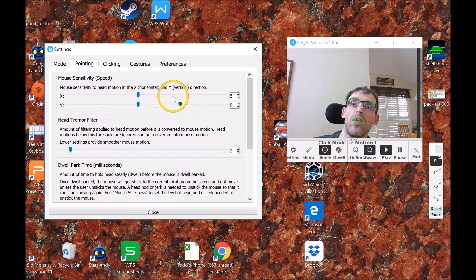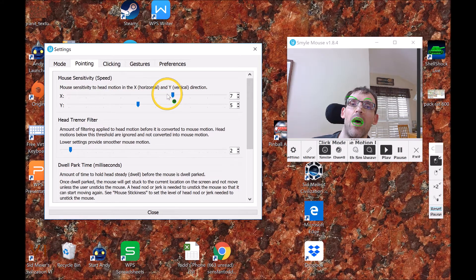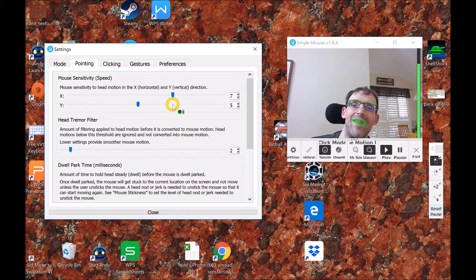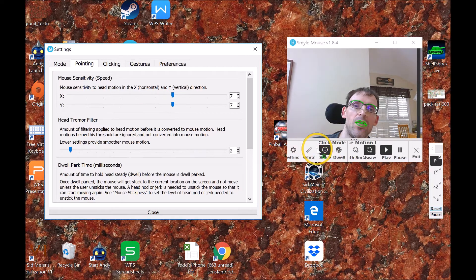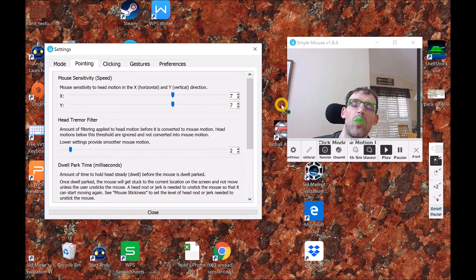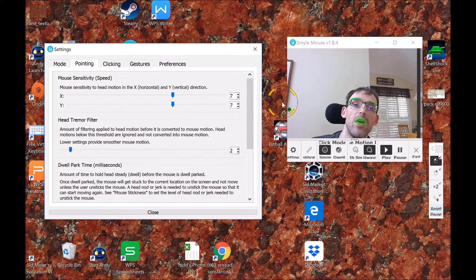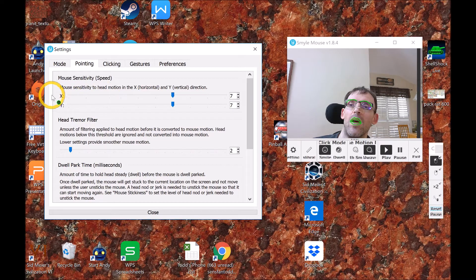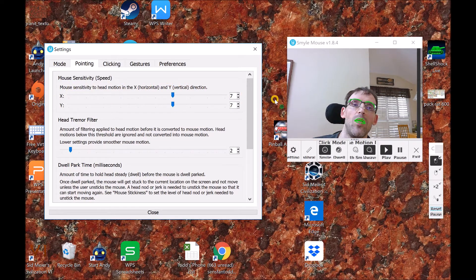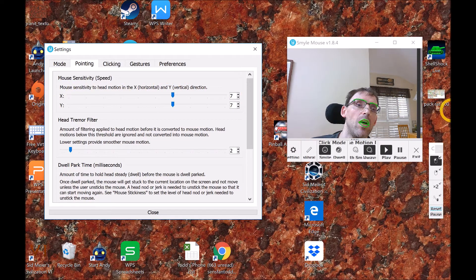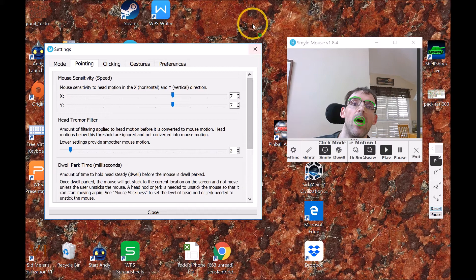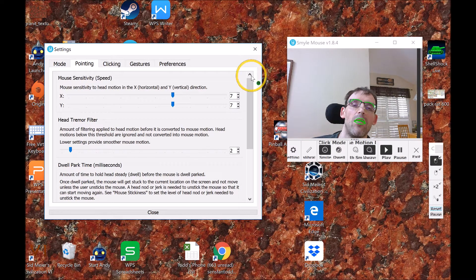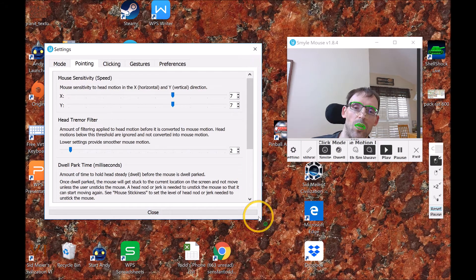So I'm going to turn them up a little bit, and as you can see, what you want with setting the speed is you want to be able to, just with a very small move of your head, cover your whole screen.